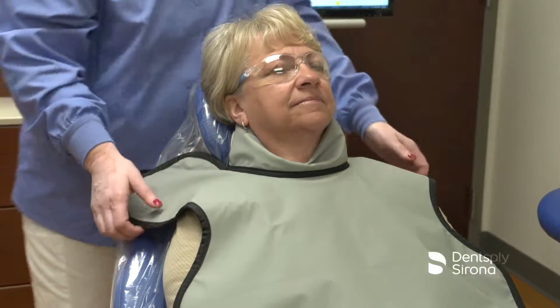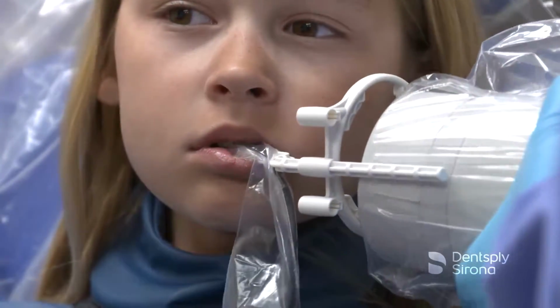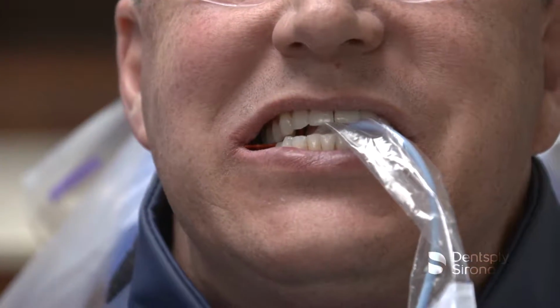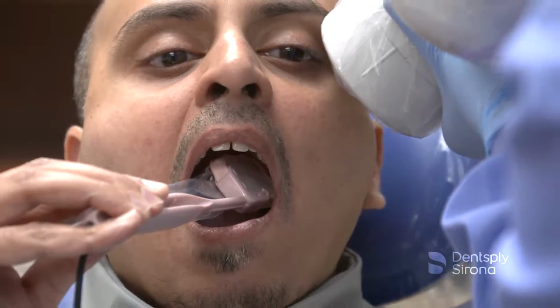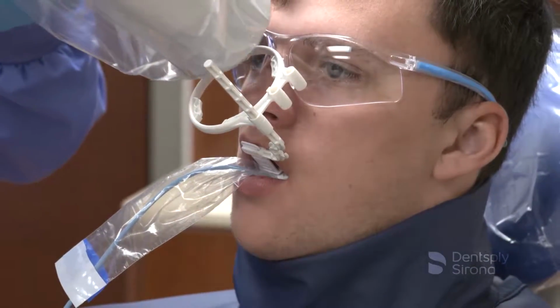Dental radiographic exams are one of the primary diagnostic tools to determine disease states and to formulate the appropriate treatment. Radiographs should be prescribed according to selection criteria guidelines. These guidelines are based on a variety of factors, including the patient's medical and dental history, clinical signs and symptoms of disease, risk factors, age and dentition, and new or recall status.